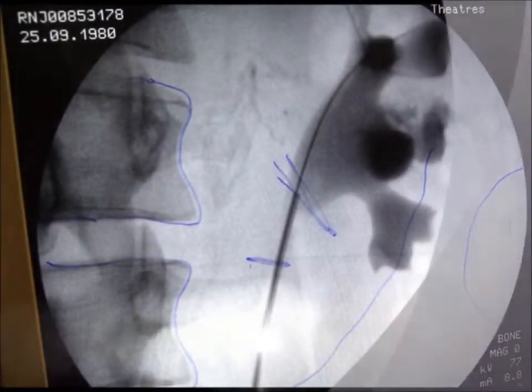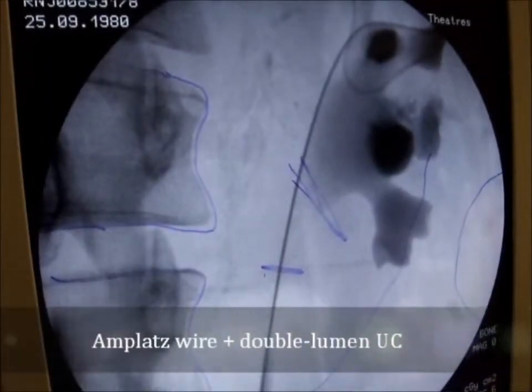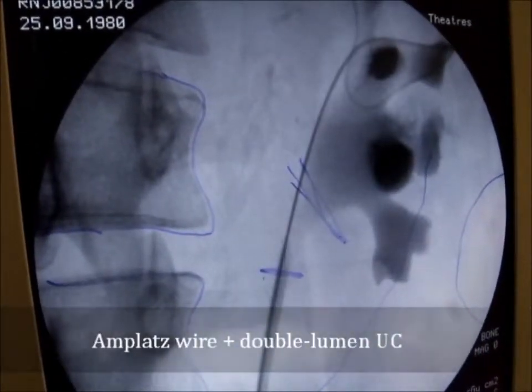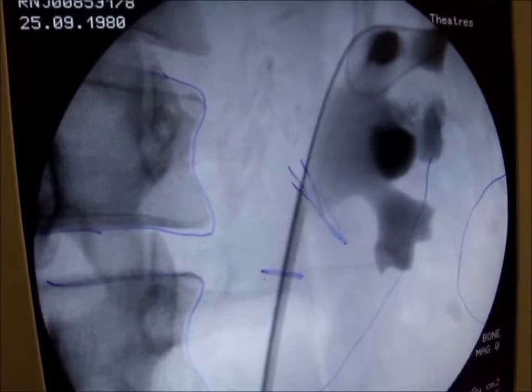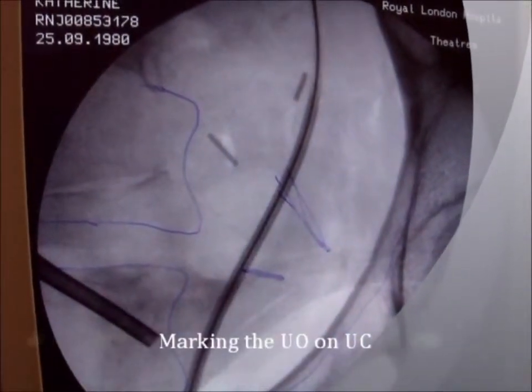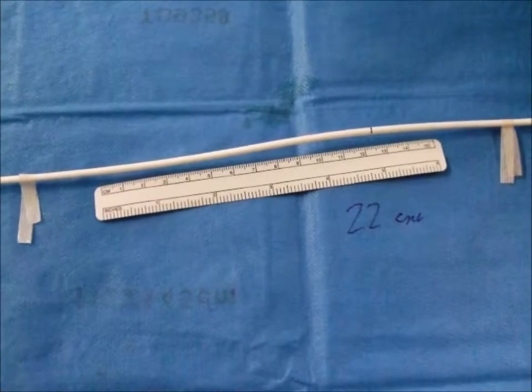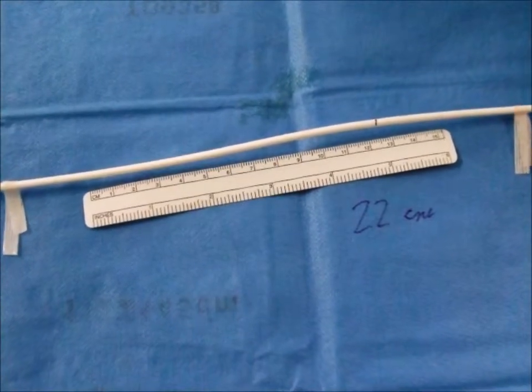The double-lumen ureteric catheter is then placed at the pelvic-ureteric junction and marked with a stereostrip at the urethral external meatus of the patient. It is then retracted to the previously marked ureteric orifice, and the second stereostrip at the urethral meatus marks the distance between the pelvic-ureteric junction and the ureteric orifice.